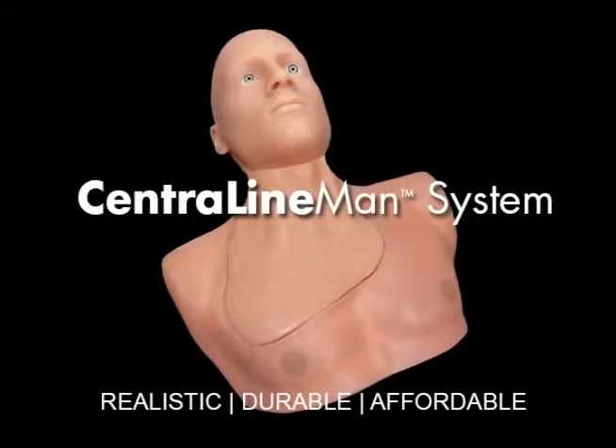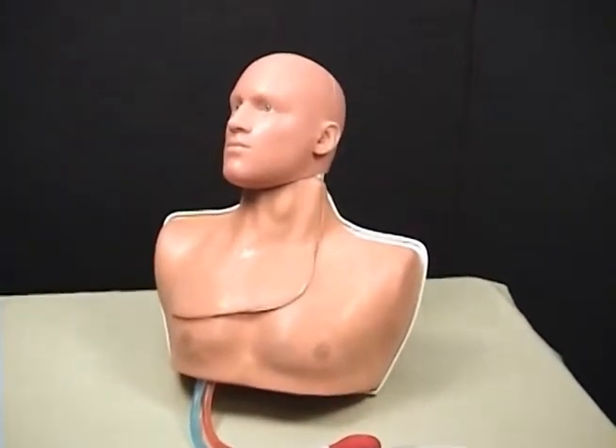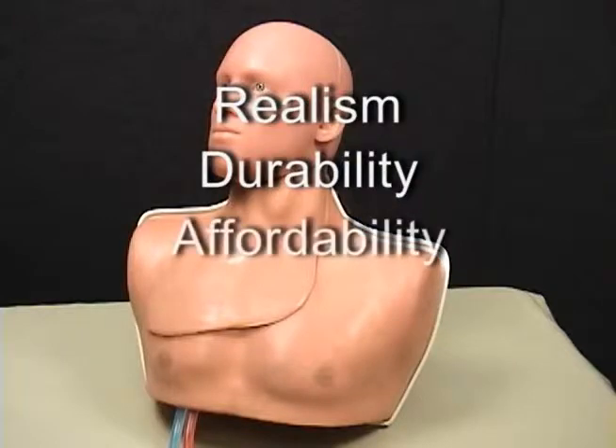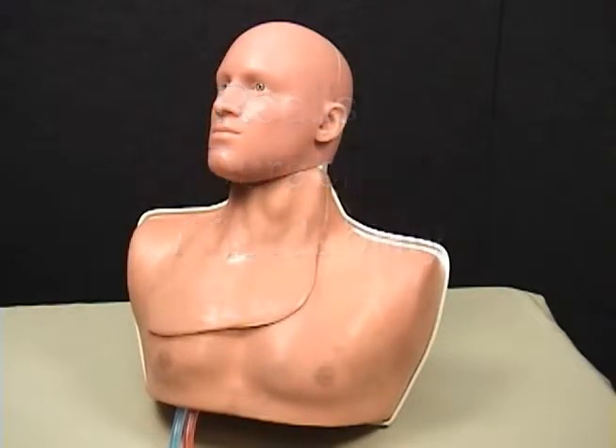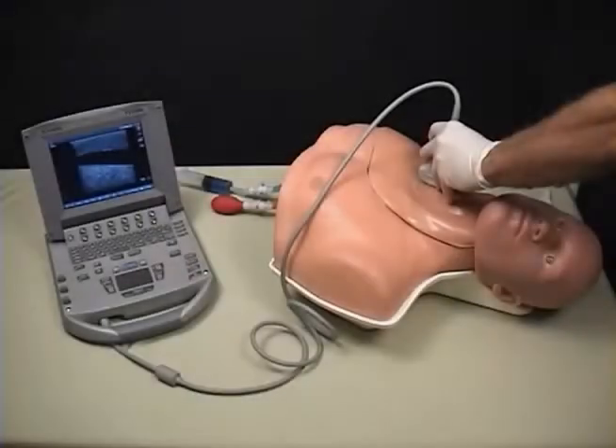As the world leader in soft tissue simulation, Simulab is pleased to offer a central venous access trainer that combines realism, durability, and affordability for maximum value — the Central LineMan system. Here is an overview of the system's key features.